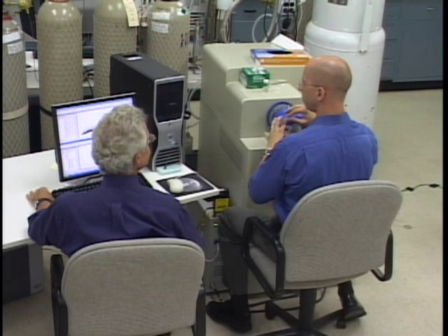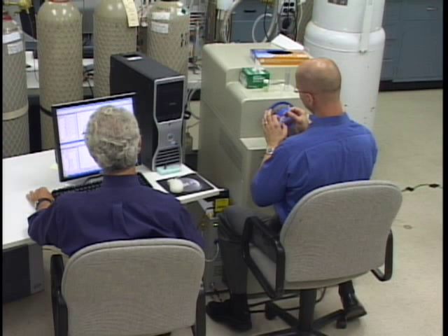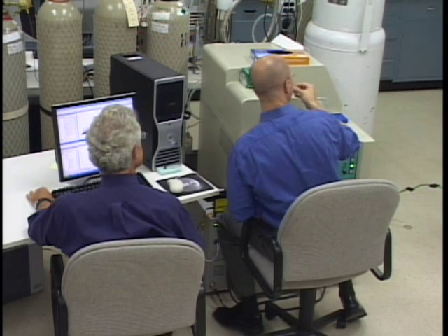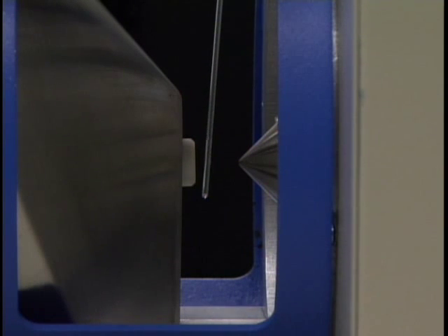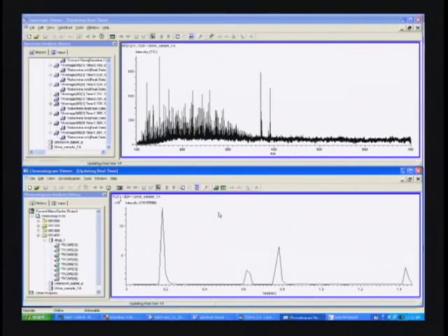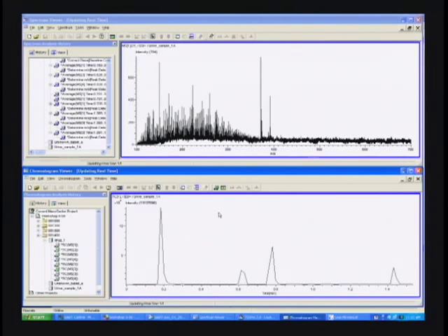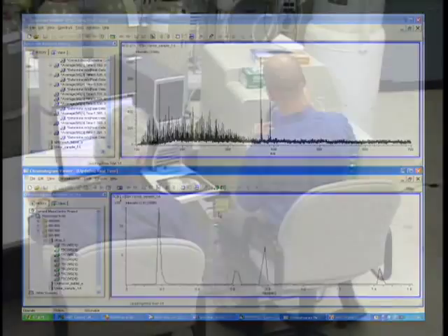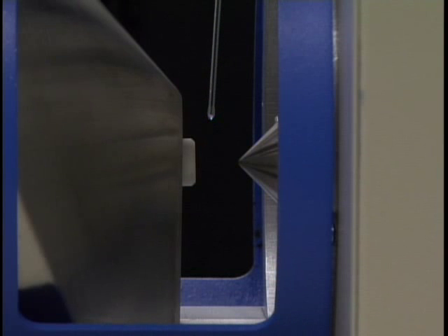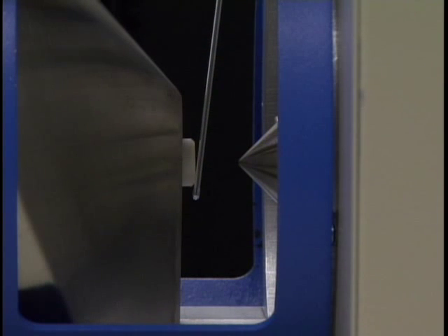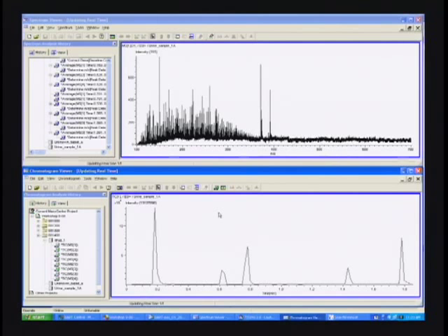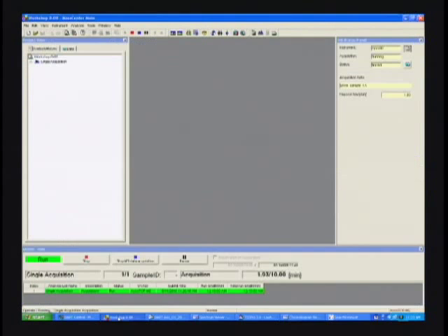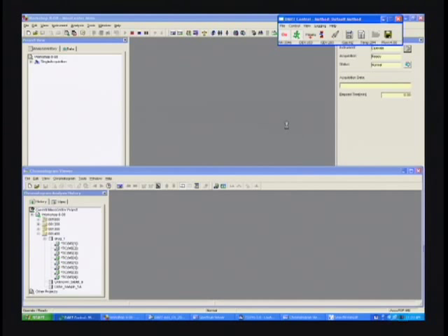Oftentimes with the urine samples, a liquid sample like that, it'll wick up the glass tube as it moves up. We tend to push the glass tube down in there and try and keep up with that stream. We've tended to run with all of these data in the same data set with PEG standards either side of it. If you go back to putting the glass tube back into your sample, you want to be careful that you let it cool down because having it in the stream, it will be hot and you can boil your sample. That's really all there is for introducing urine into the stream. Let's put the DART back on standby.